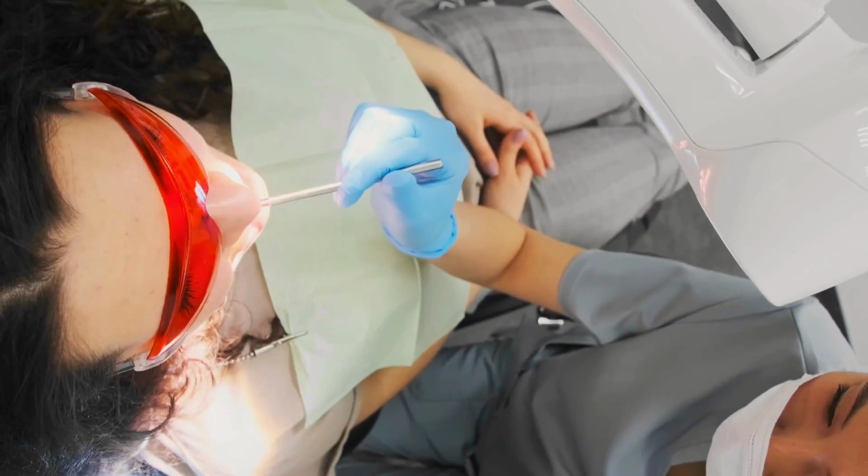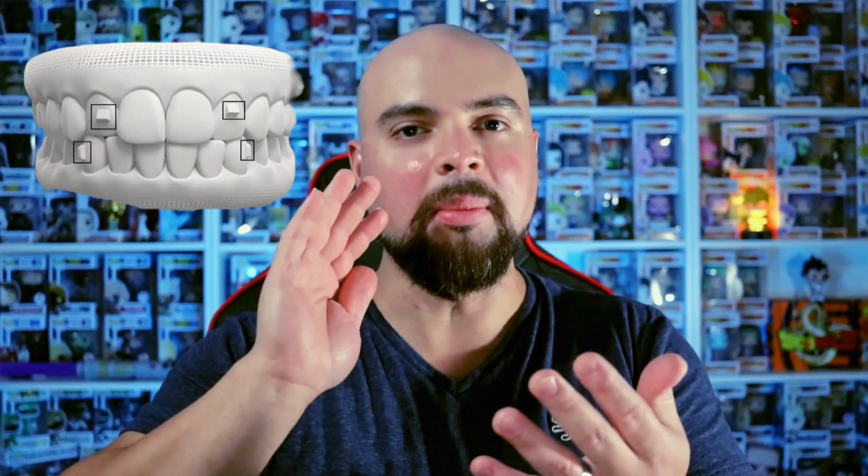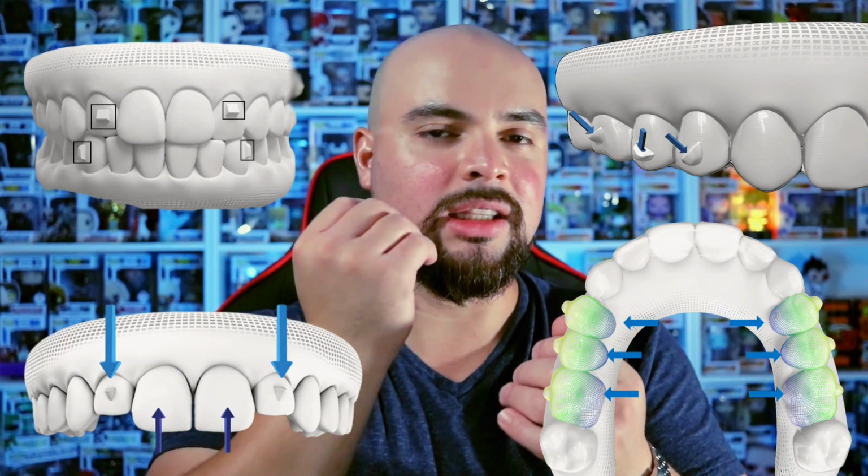Now there are multiple videos on YouTube that I recommend you watch that will show you what buttons do, but essentially they're placed in specific spots on your teeth to make sure they apply pressure and either turn, pull, or push teeth into the correct place. It's actually pretty interesting. You should check it out.